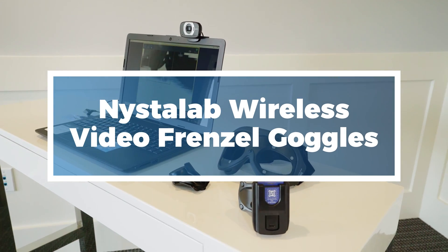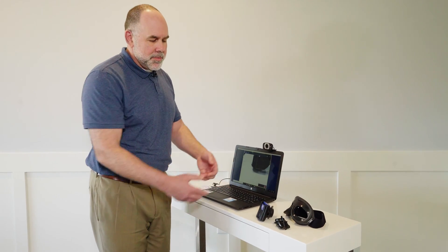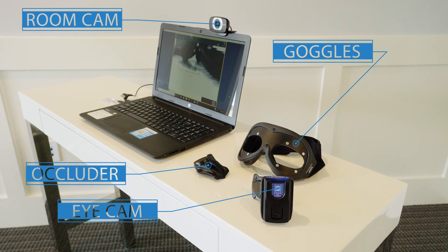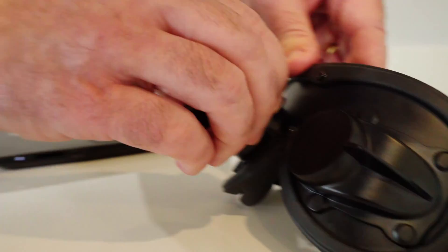As you can see, I've started the system including the room camera and then we have the goggles themselves. The interesting feature about the goggles is you can determine which eye you want to test based on whether the patient has a dysfunction in one eye versus another. For example, say we want to test the right eye — we can put the camera in the right eye.